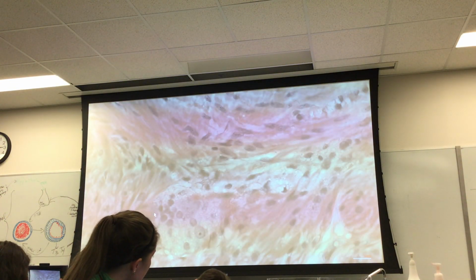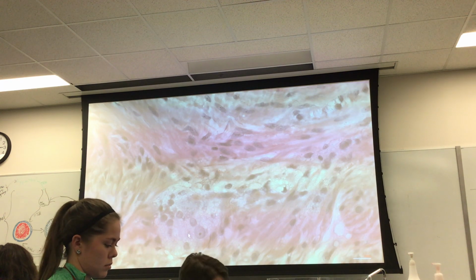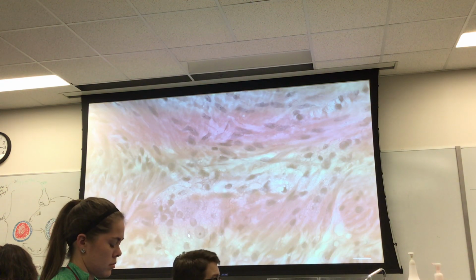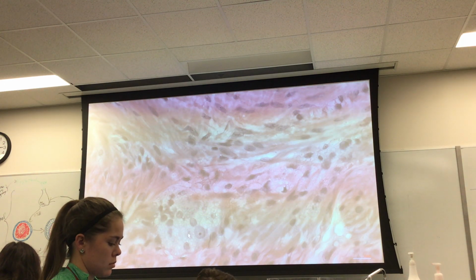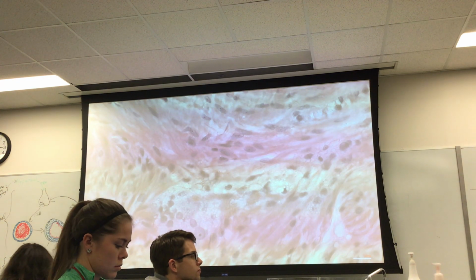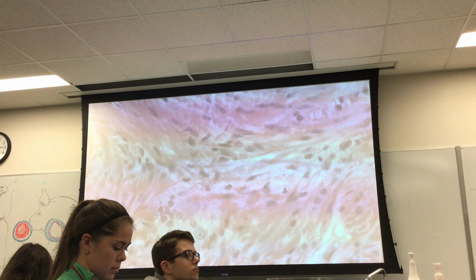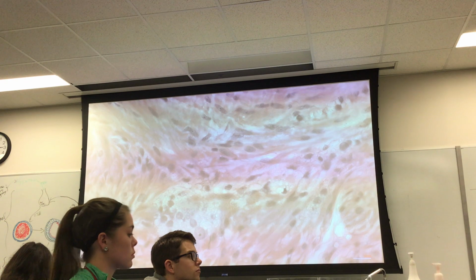So again, let's look at this in a little higher magnification. In this case, because we're surrounded by smooth muscle, preferably of two different orientations, but we've got collections of neurons, well, that one's called the myenteric. So that's submucosal, surrounded by dense irregular connective tissue, and when you're associated with smooth muscle, that's myenteric. And again, you'd have to be told this is an organ of the GI tract, because honestly, it's not fair, you guys don't know that yet. This time next year, you'll clearly identify that, but that's how you do that.